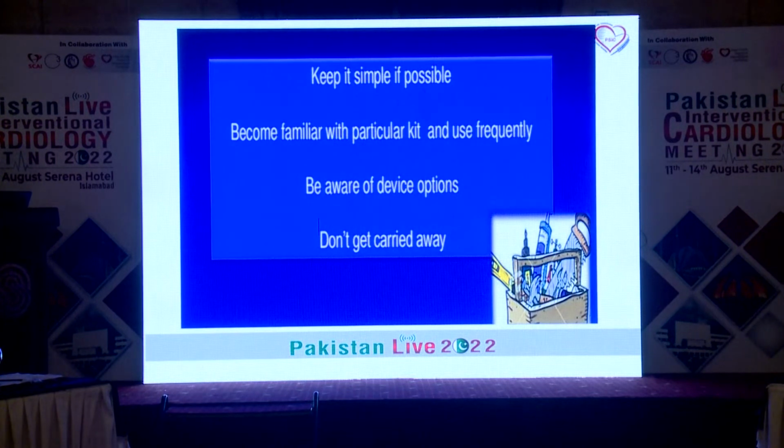So now your toolbox should be as simple as possible. You should be familiar with the kit and use the same things frequently. And you should be aware of your device options. And don't get carried away. And always remember that in a CTO PCI, failure is acceptable, complications are not. Thank you very much.